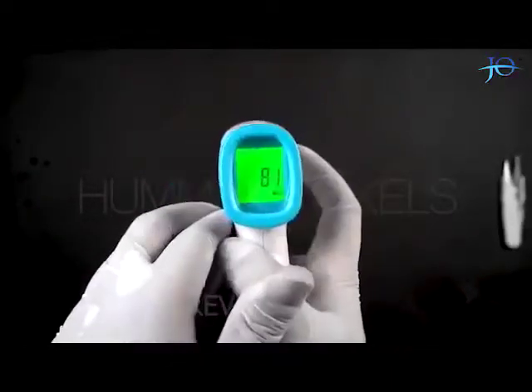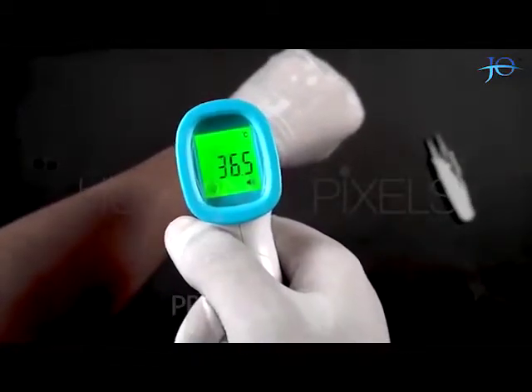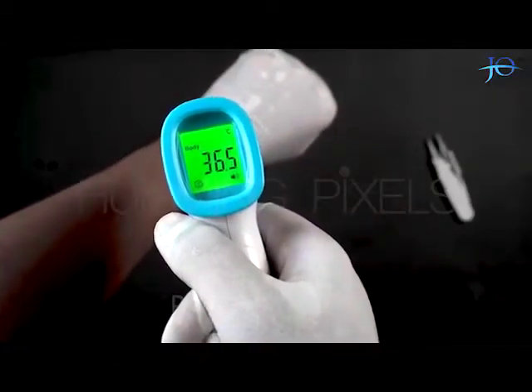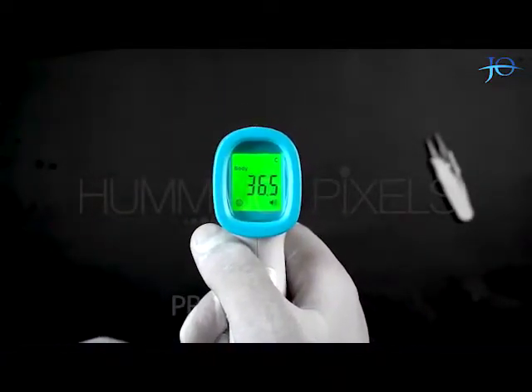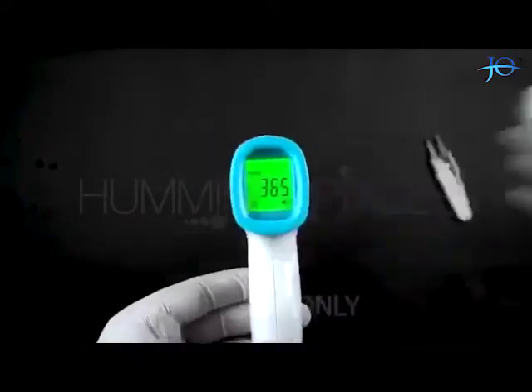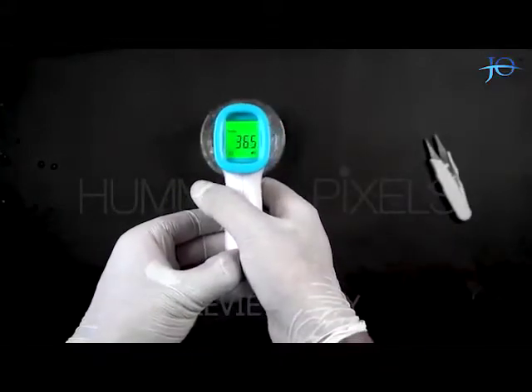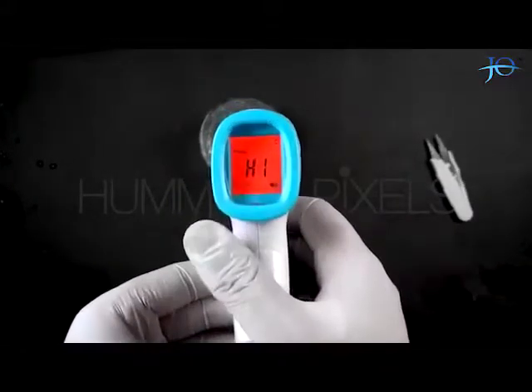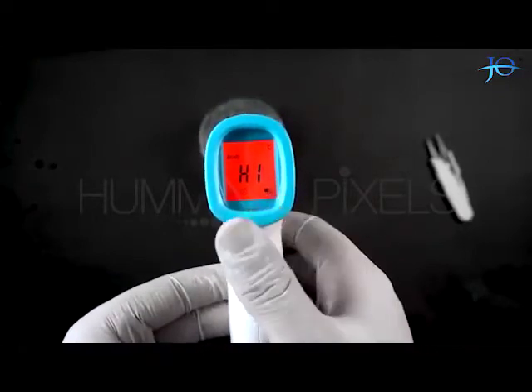Now we will see how it works in body mode by pressing the Mode button. I will check my body temperature by pointing the sensor towards my hand — and here we have the reading on our screen. The green light indicates that it's a normal body temperature. Now I will use a cup of hot water to see how it reacts to a high-temperature body. It is showing red color along with a temperature warning, indicating this is not a safe temperature.